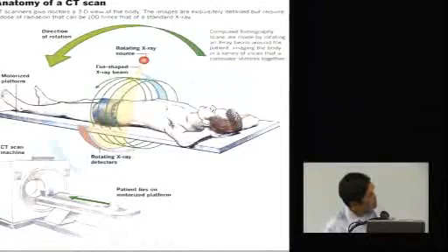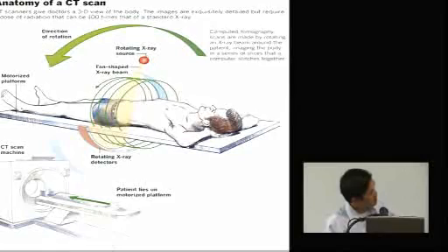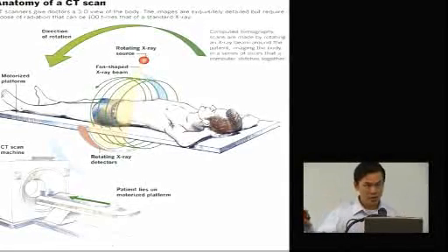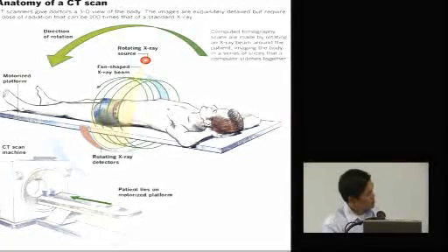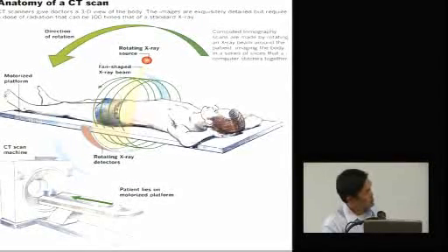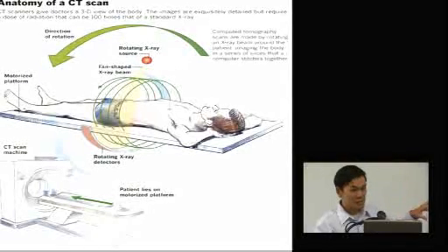It's a very clever device. Here's a schematic. Here you have the X-ray source on one side, and mounted 180 degrees away from that source is a detector. Thinking back to standard X-ray, which I think most of you understand, this shoots a beam of X-rays through the patient, and the detector acts like the film. Except here the X-ray source is rotating through the patient's body and constantly taking pictures many times a second.